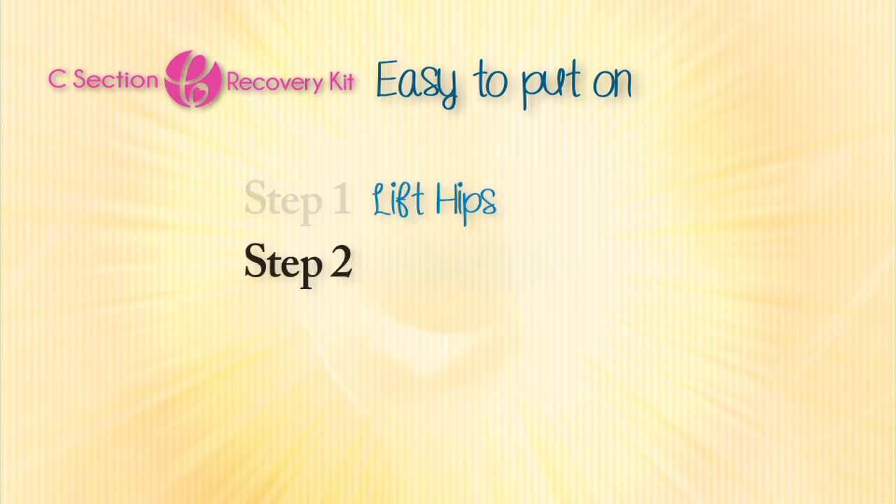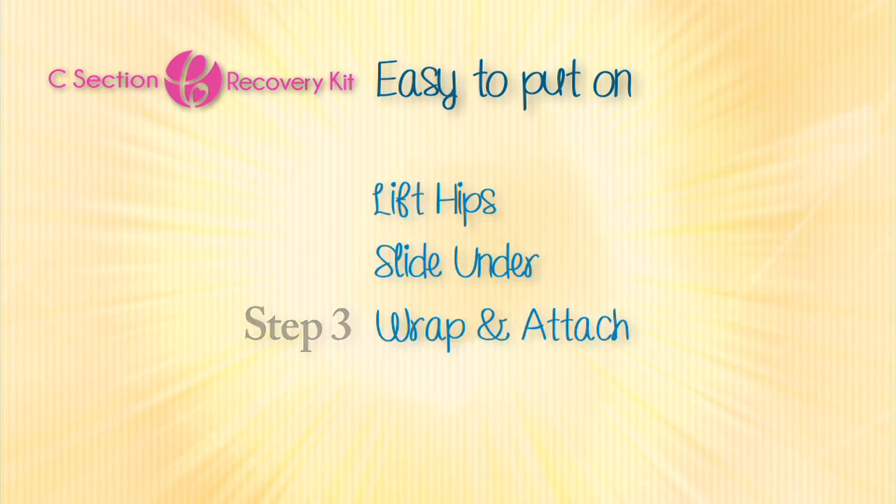It's easy to put on as one, two, three. Lift your hips, slide the belt under your body, wrap snugly, and attach.